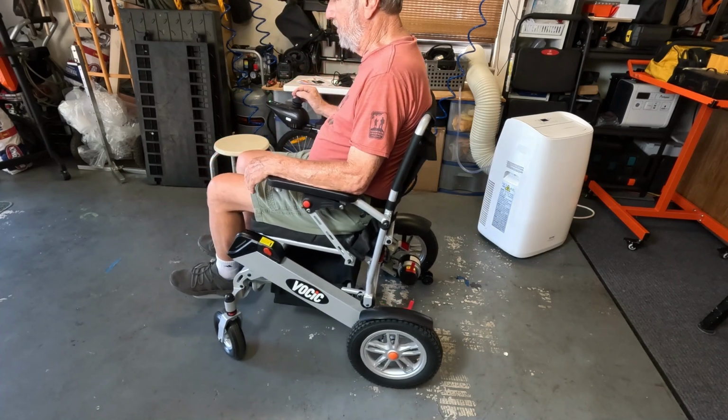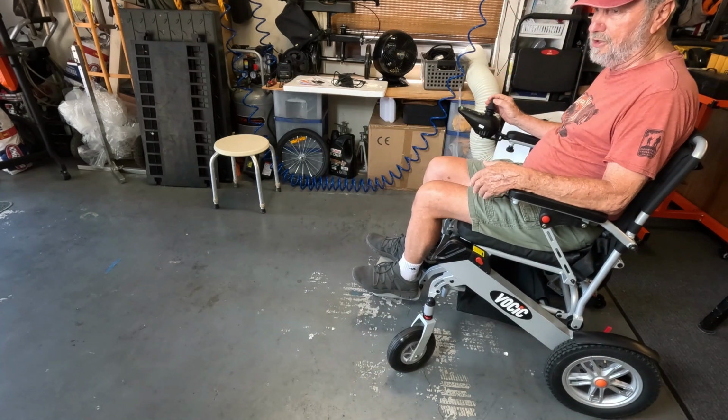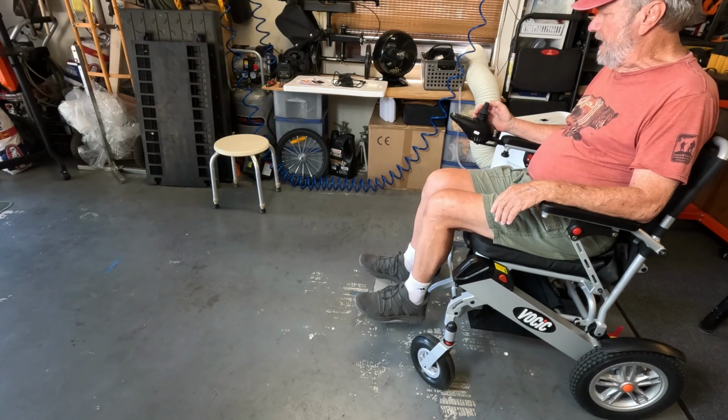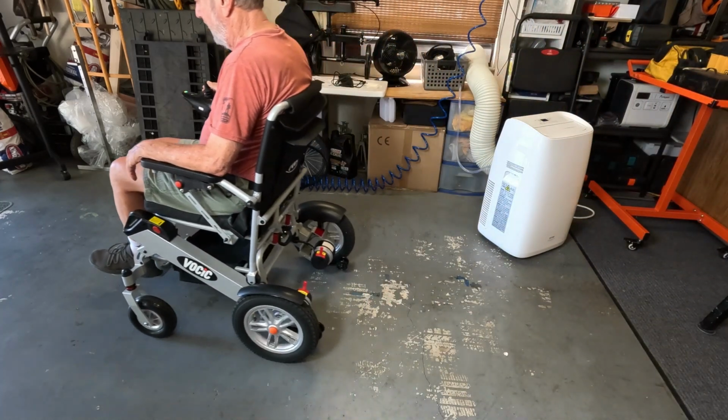I'm still getting used to it, and then I can back on up, and when you're backing up, you're going to hear a little beep that's alerting people that you're backing up. And that's pretty much the way it goes. And there we go.